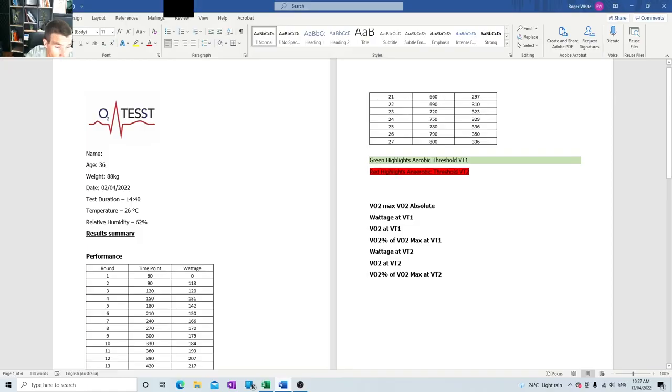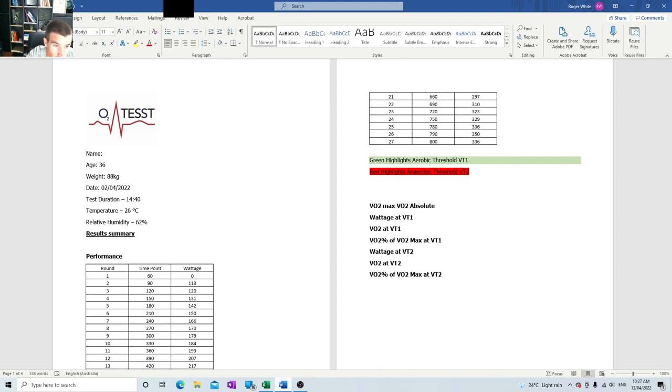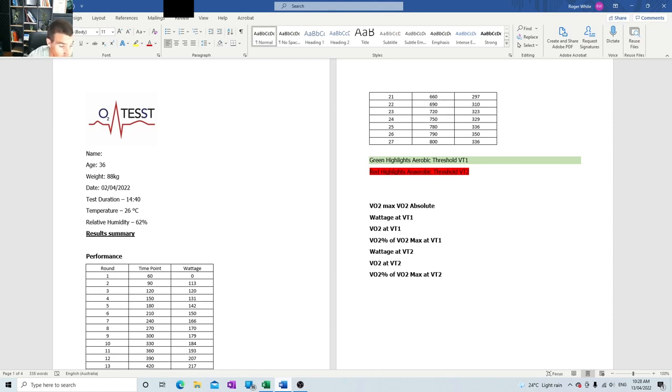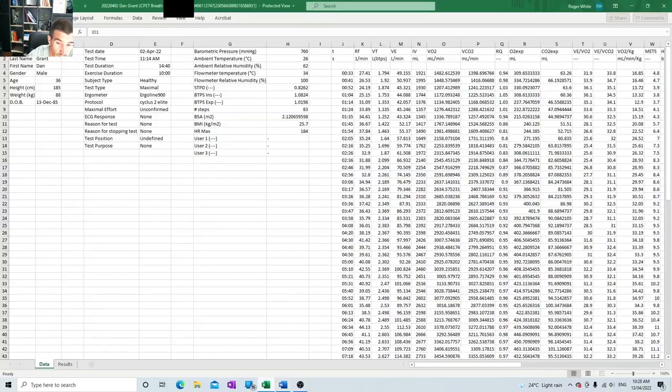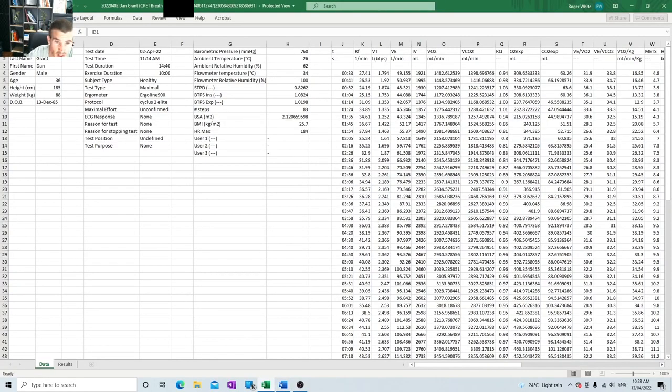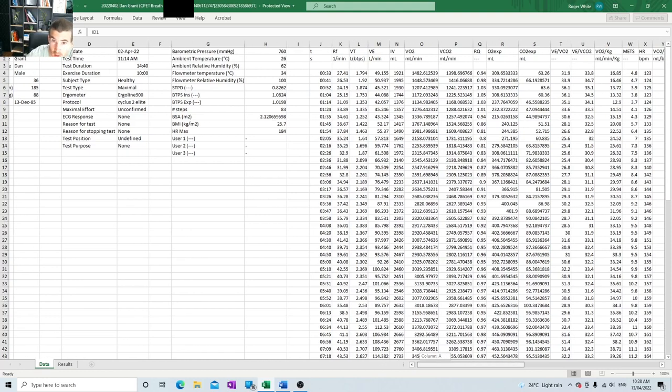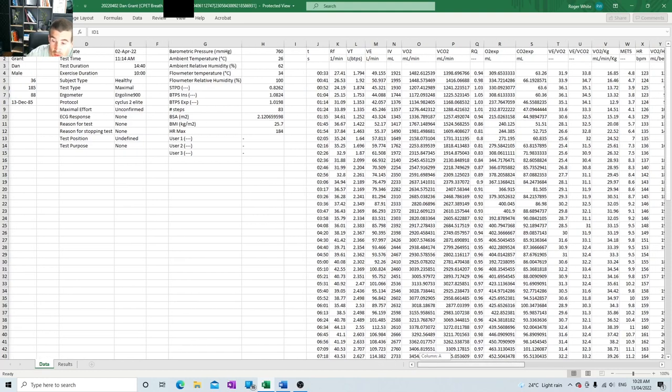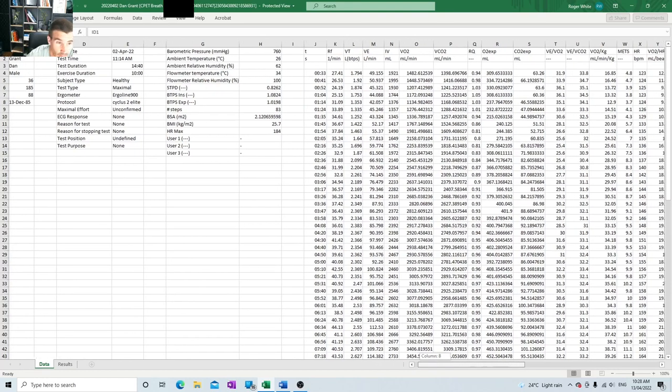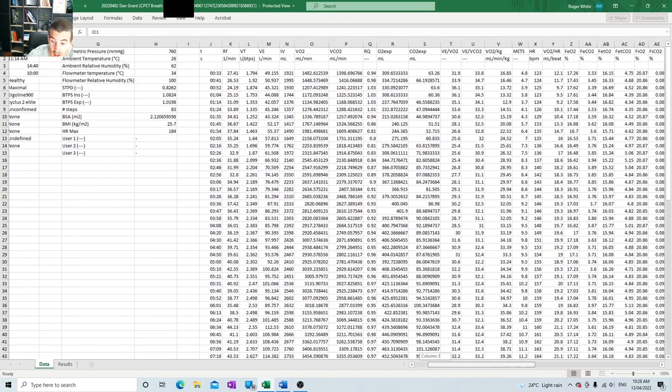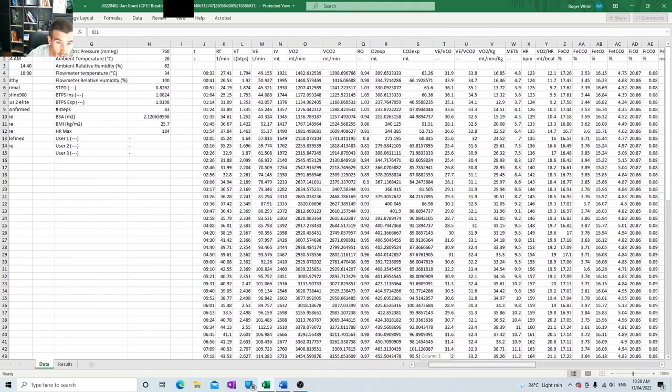All righty, so today I'm going to be going through how I established a VO2 max report using data obtained during an incremental step test using the COSMED quark, which is my metabolic cart. This test was done on a rower. The machine will spit you out all of this data, which alone makes very little sense, just a lot of confusion. So we're going to be going through a little bit of a tutorial today on how I make sense of this data and then relay that in a report to the client.